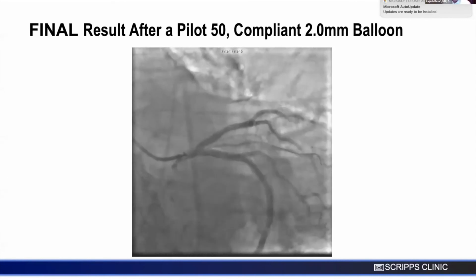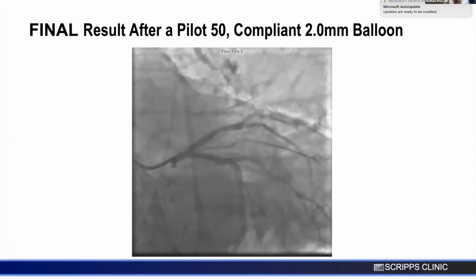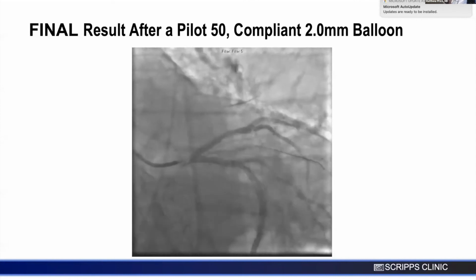There are just too many vessels. So this is when provisional stenting becomes problematic. But I wouldn't have actually changed my approach, other than maybe being a little more aware of that diagonal initially. But even looking back, it did not seem like something terrible that would need to be covered.